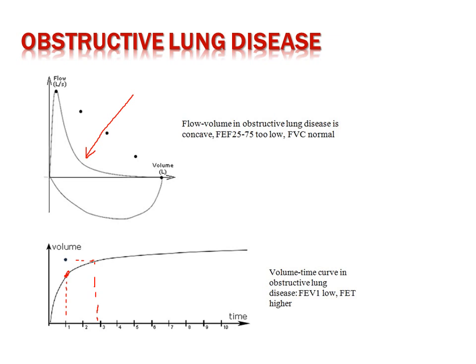That's what we see in obstructive lung disease. Please look at the upper figure. The upper figure shows the flow volume loop in obstructive lung disease.